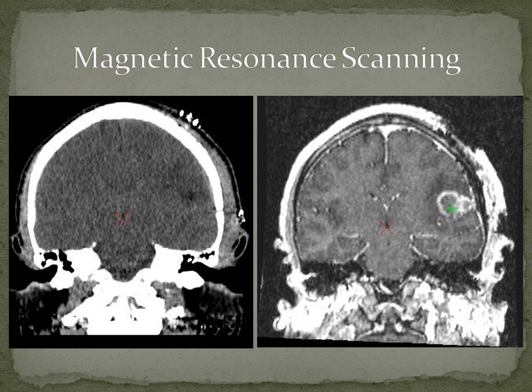We have gone to the extent that we actually do not give contrast to our tumor patients that we have MRs on any longer. We do the stereotactic imaging. We use that CT scan to actually relocalize and register the MR data set, but we actually don't give contrast anymore for our CT patients. So today, the only patient getting contrast is the one patient getting the CTA.